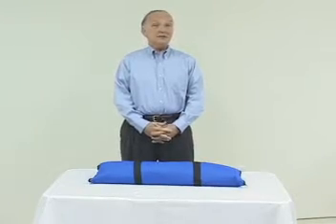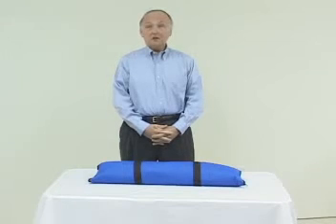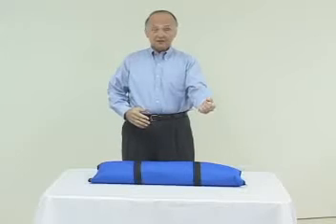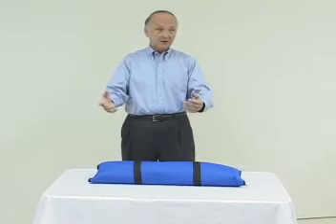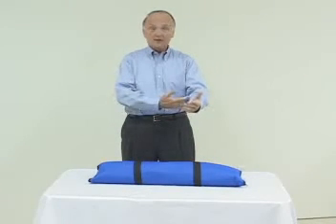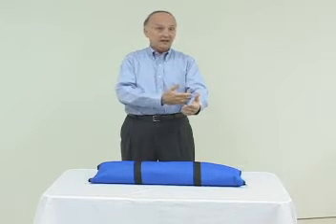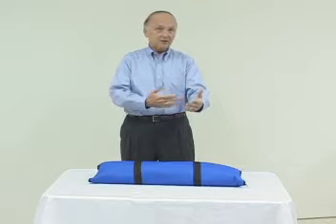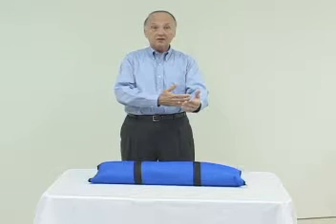Hello. This discussion relates to the family of GOMARD IV arms. We have arms left, arms right. We have arms that are single purpose for IV and multi-purpose for IV, IM, and sub-Q, and of course intradermal. We also have an arm that adds arterial capability.